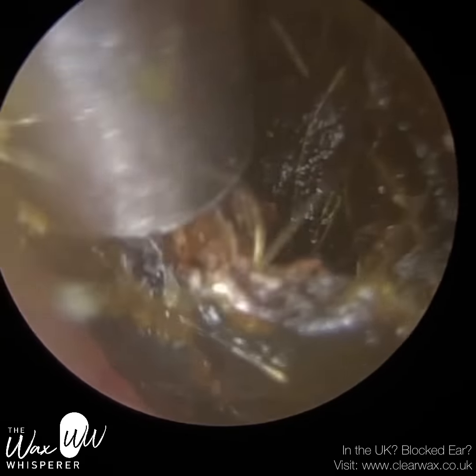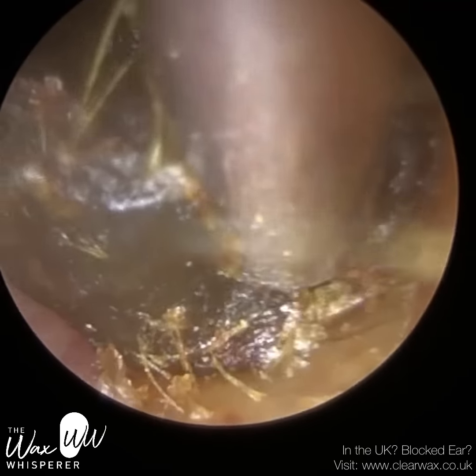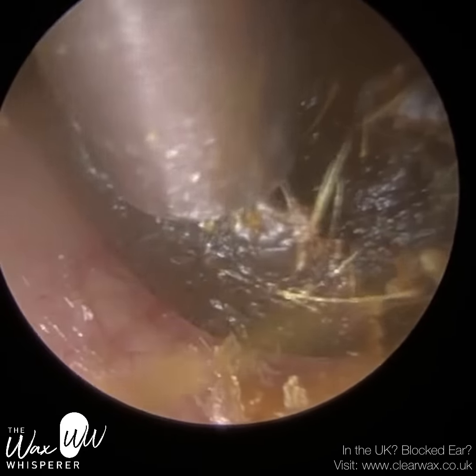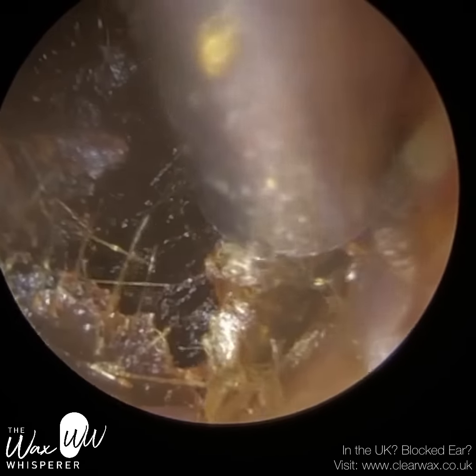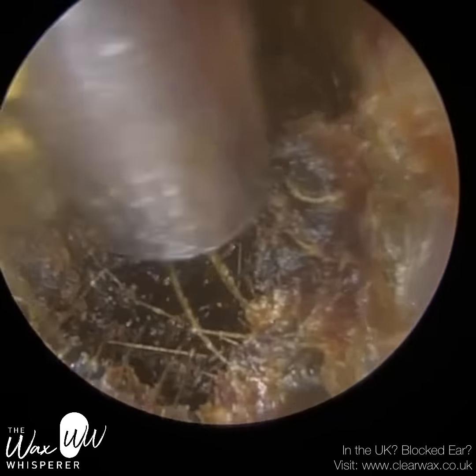So with this wax plug, I'm just going around the perimeter, trying to detach the wax plug from the ear canal wall. This is the back part of the ear canal, this is more of the anterior front part, and we've already loosened the inferiors of the base of the ear canal. So you can see we're just going all the way around.